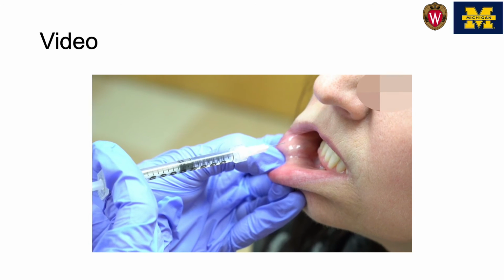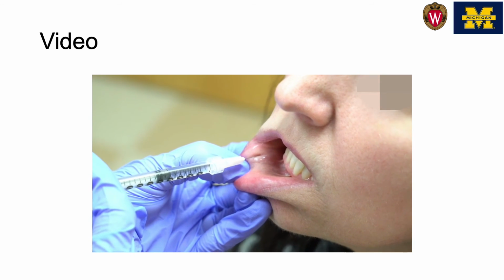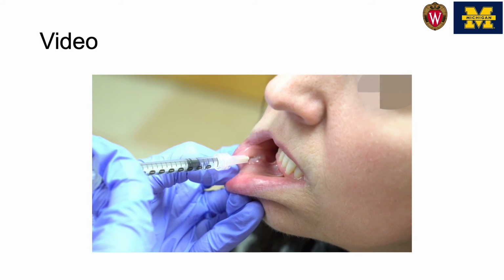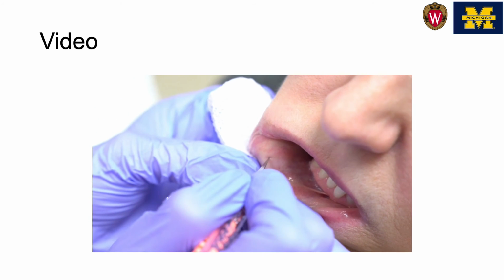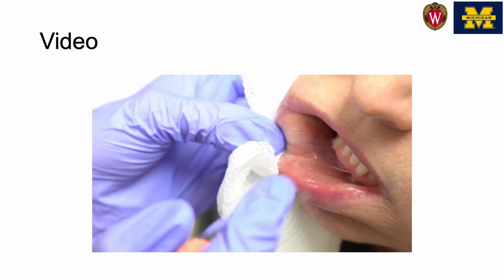All right, let's go ahead and get started. Here we're injecting 0.4 cc's of lidocaine with 1 to 100,000 epinephrine, using a TB 30 gauge needle in a 1 milliliter syringe. I wait about 5 minutes, allowing hemostasis to occur, before actually beginning the incision.